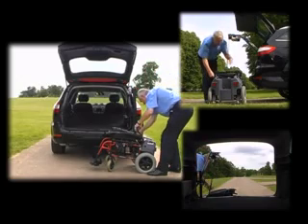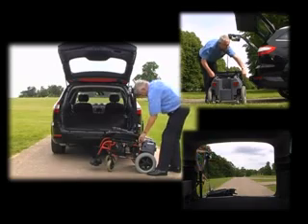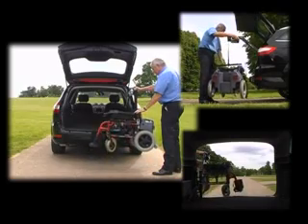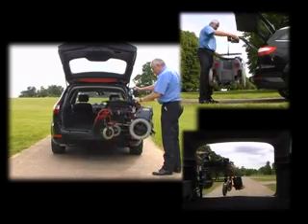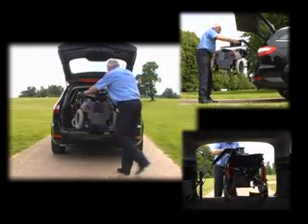Our specially designed keyhole plates enable easy single-handed attachment of the wheelchair or scooter to the hoist. This hoist provides a cost-efficient solution for those with enough strength and dexterity to swing the wheelchair or scooter in and out of the vehicle's luggage area manually.